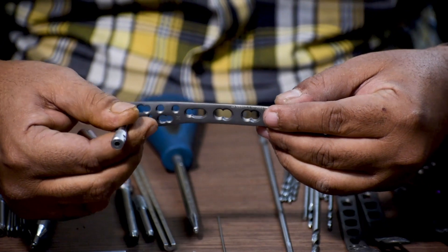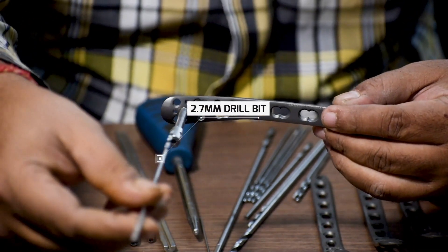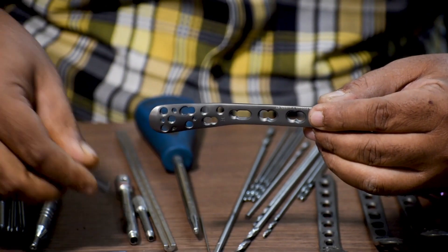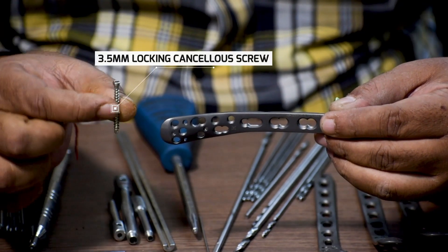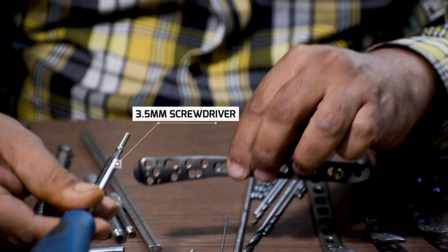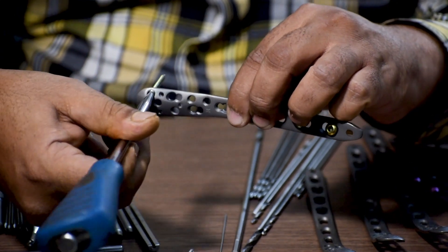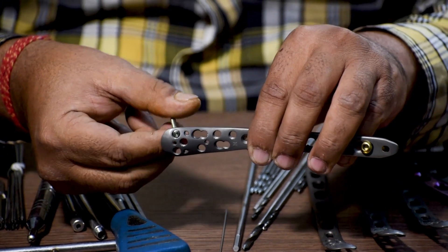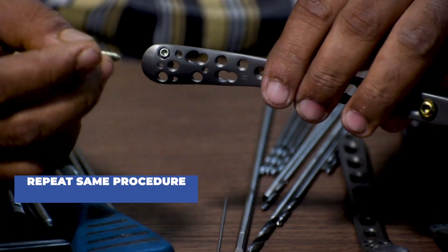In order to fix the distal head of the plate, for the 3.5 mm locking sleeve we will use a 2.7 mm drill bit. After drilling through this sleeve, we remove it and fix a 3.5 mm locking cancellous screw, because the distal part is always cancellous. This screw is fixed with the help of a 3.5 mm screwdriver. We repeat the same process to fix all the other screws in the distal end of this plate.